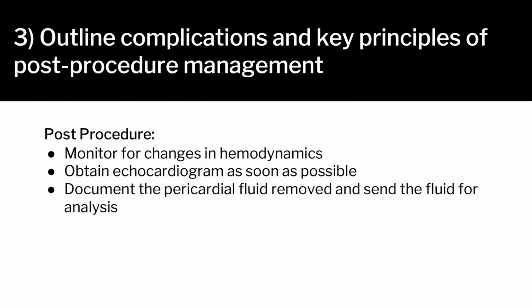Post-procedure, it's important to monitor for changes in hemodynamics. It is also important to obtain an echocardiogram if available once spontaneous circulation is achieved. Finally, document the pericardial fluid removed and send the fluid for analysis, including cell count, protein, and culture as indicated.